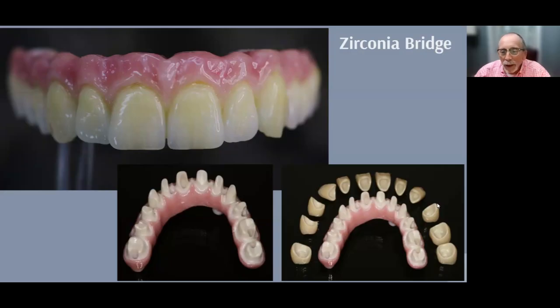So things have been done in the past, and some people are doing this still today, where we change the design of how we do this. Instead of a solid piece, we take away some of the bulk and make it as a prep form or a thimble type thing. Some call it a thimble prep, where the main framework looks like tooth preps. And then we make crowns or bridges to cement on top of that, with the goal or hope that we're reducing the overall bulk of the big part of the bar. And that if anything does break, hopefully it'll be one of the crowns or bridges, and we can leave the main framework in the mouth and just replace the outer crown. That's a reasonable solution, and it has worked well.